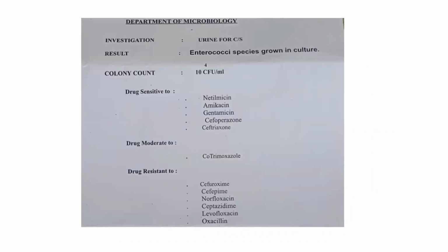Yeah, this is another urine culture where you can see disk diffusion is the probable test they have used, and here again it's just mentioning sensitive, moderate and resistant. Yeah, so that's it. Anything else you have to ask, Dr. Anoop?